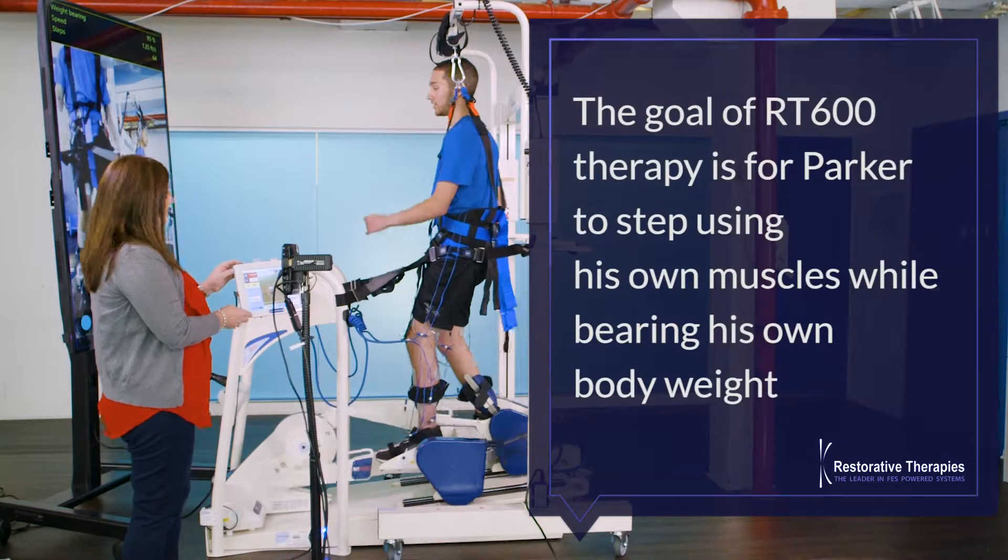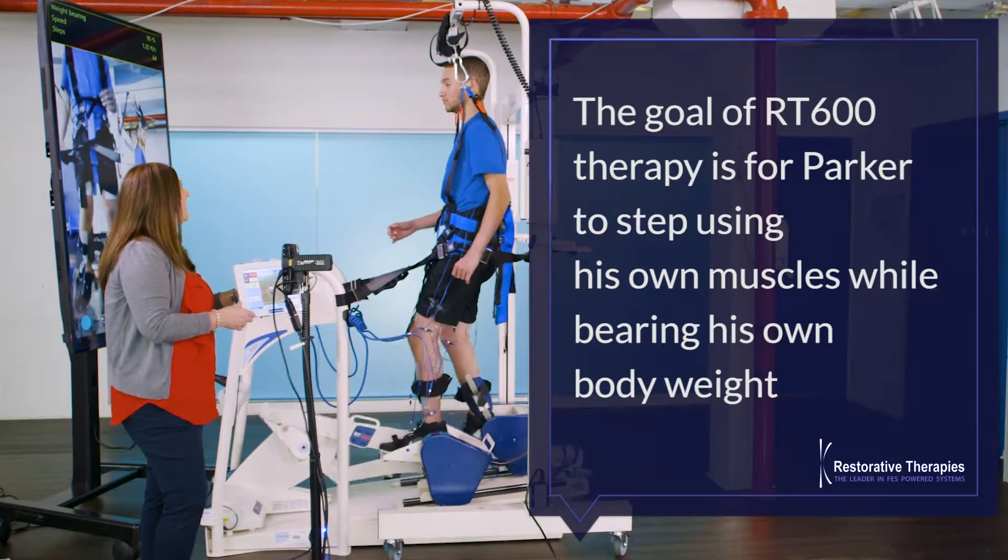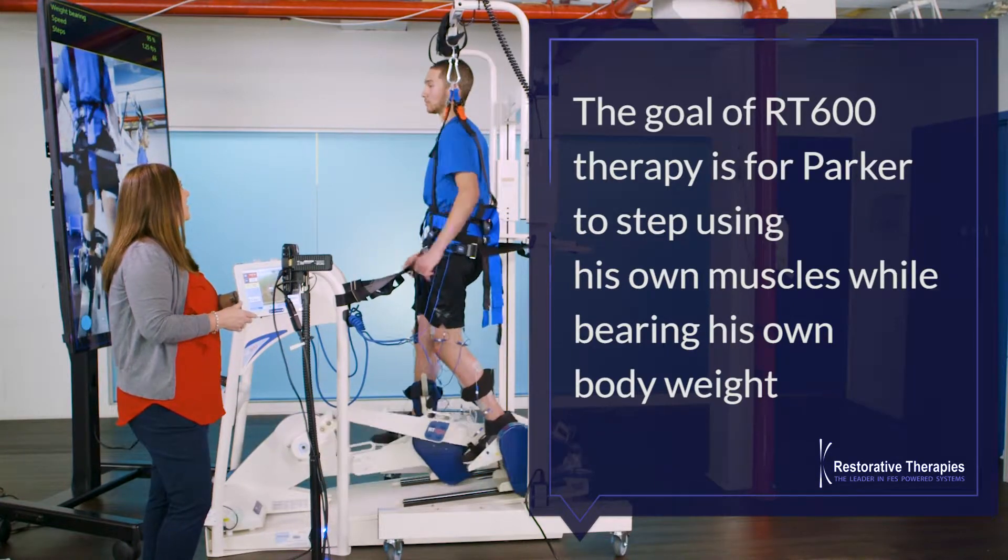I would like to review these features with you with assistance from Parker, who presents with a C4 incomplete spinal cord injury.